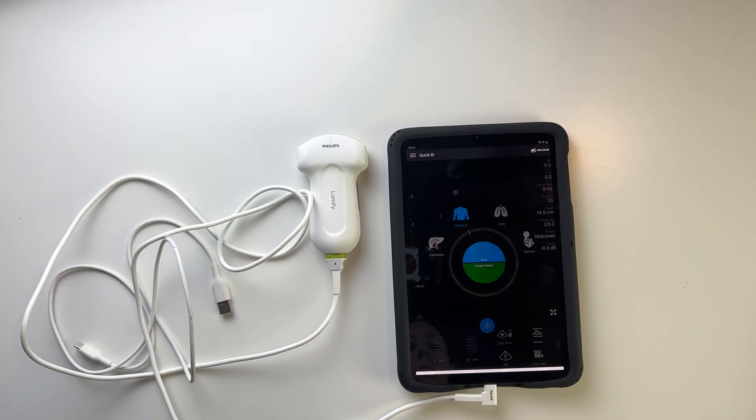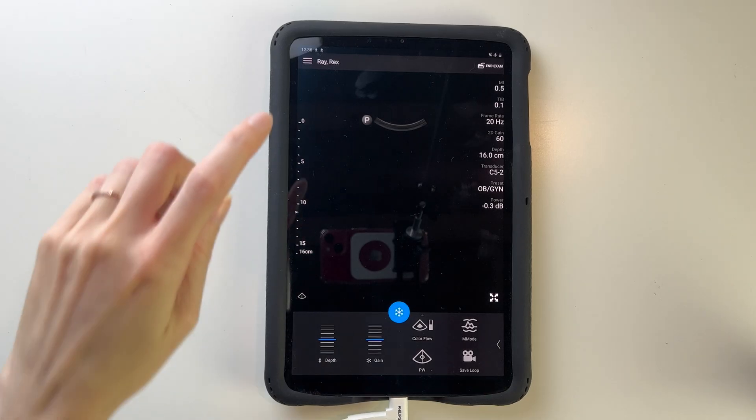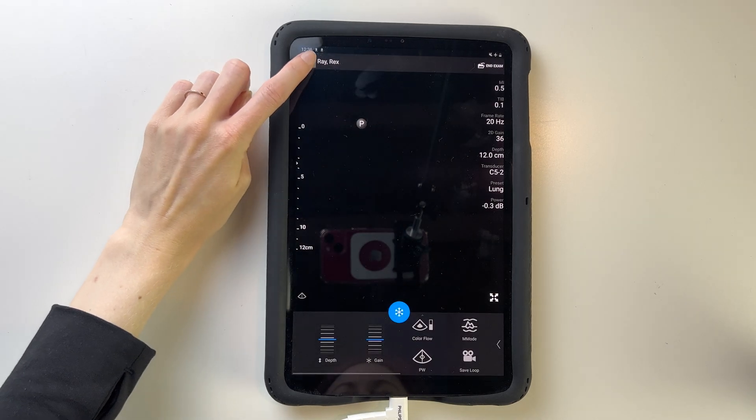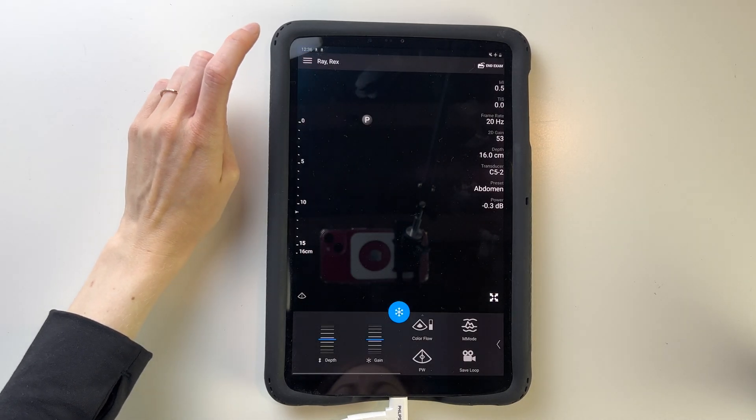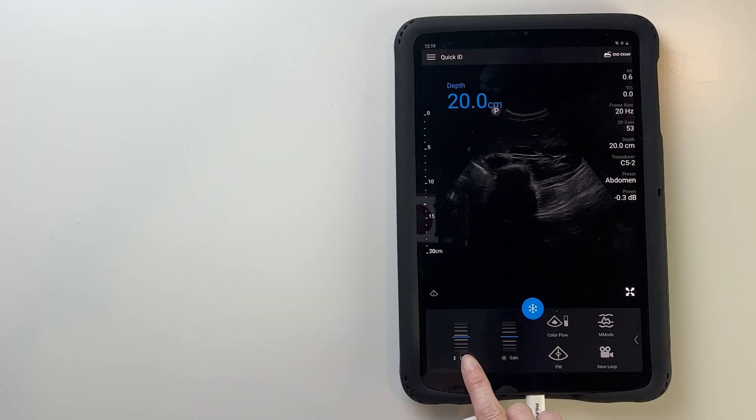Using the device is very easy. Once you plug it in, you can use a preset such as abdomen, lung, gallbladder, and OB-GYN. The preset options will change depending on what type of probe you plug in, and from there you can make further adjustments.